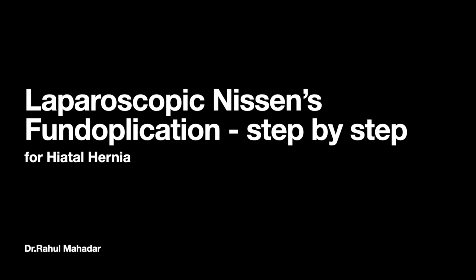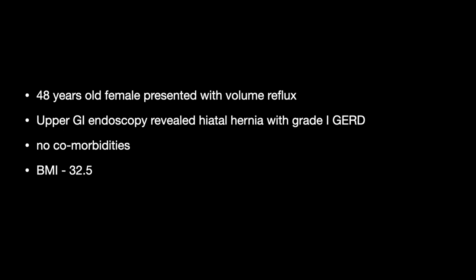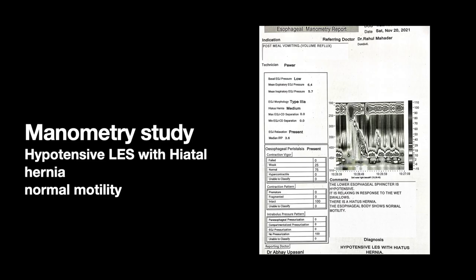Today I am going to present laparoscopic Nissen fundoplication step by step for hiatal hernia. A 48 year old female patient presented with volume reflux. Upper GI endoscopy revealed hiatal hernia with grade 1 GERD. There were no comorbidities in this patient and her BMI was 32.5. Manometry revealed hypotensive LES with hiatal hernia and normal motility of the esophagus.